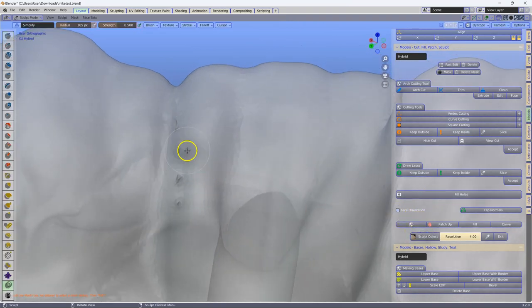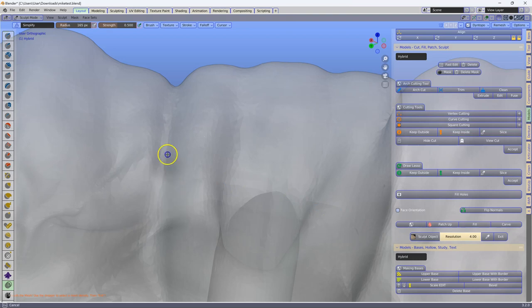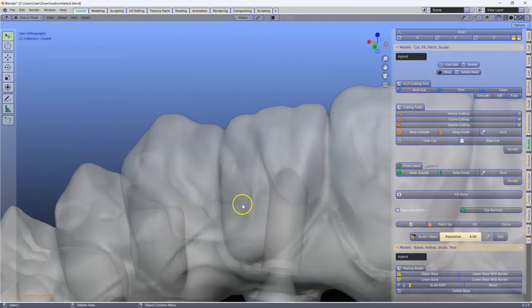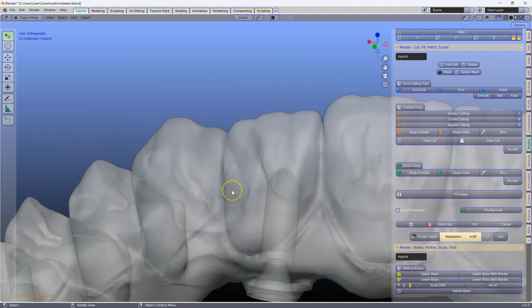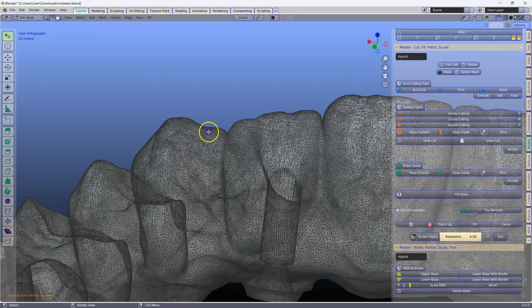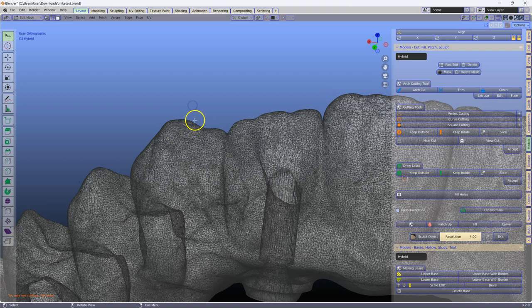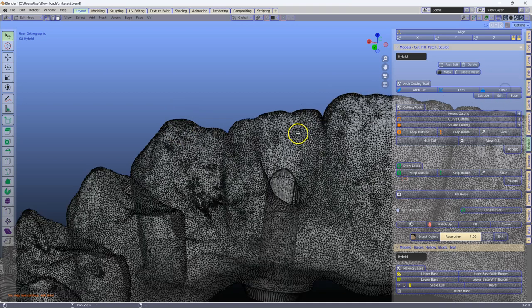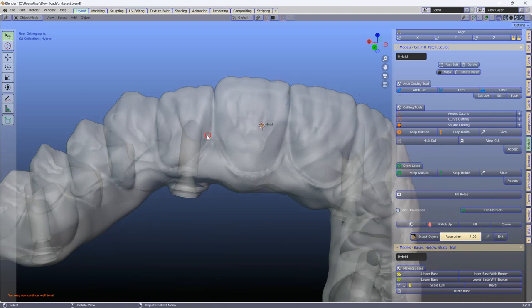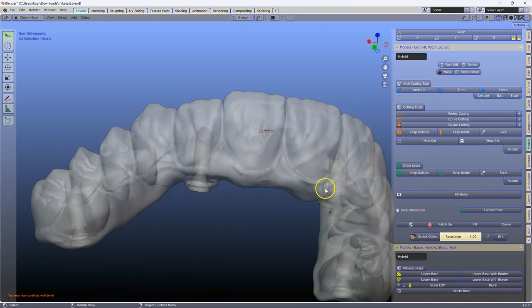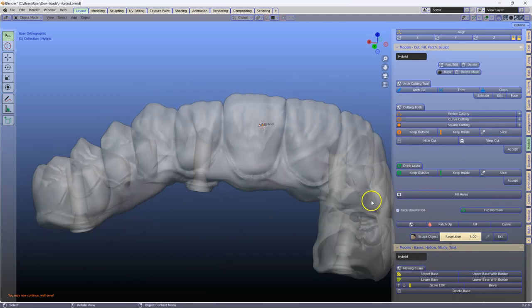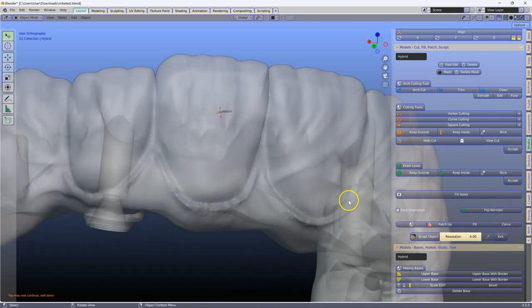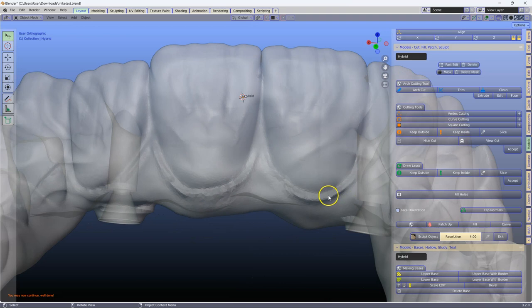Go into edit mode, select anywhere of the mesh you want to keep, click on clean, and that has gotten rid of everything on the inside. Now we have sufficient space to create an i-bar.